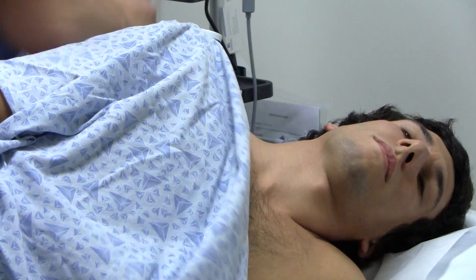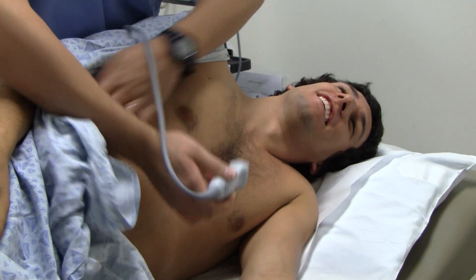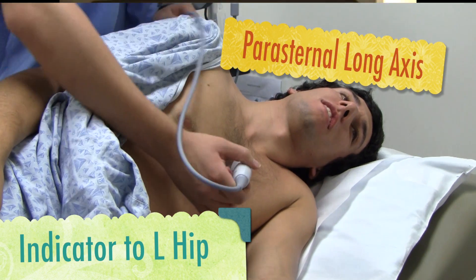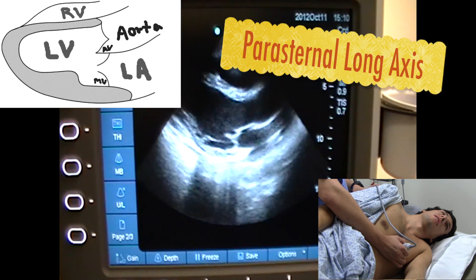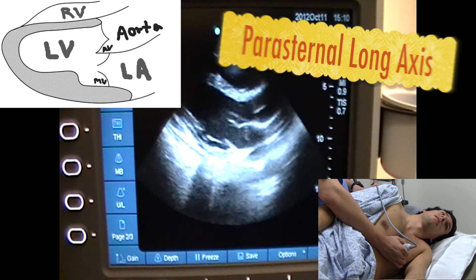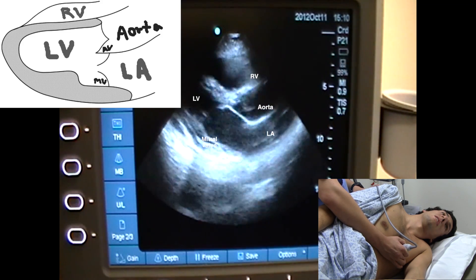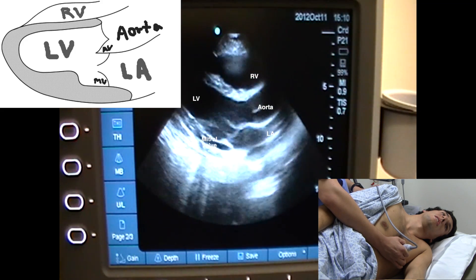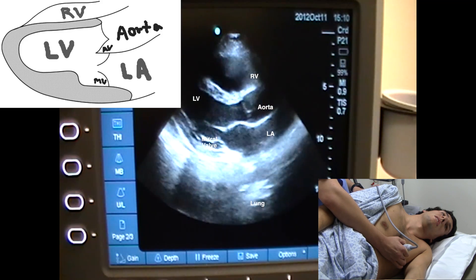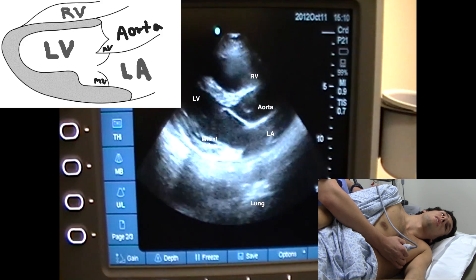We're going to have the patient lean over. When you have a chance, always try to get the patient in this position. You're going to use the ultrasound probe with the indicator towards the left hip to get a parasternal long axis view. This is a good parasternal long axis view. The first structure you'll see most anteriorly is the right ventricle. You can also see the left ventricle, the left atrium, the left ventricular outflow tract, the aortic valve, the mitral valve, and the descending aorta. Below the heart is lung, which is why you don't see a great image there — lung diffracts all the ultrasound waves.